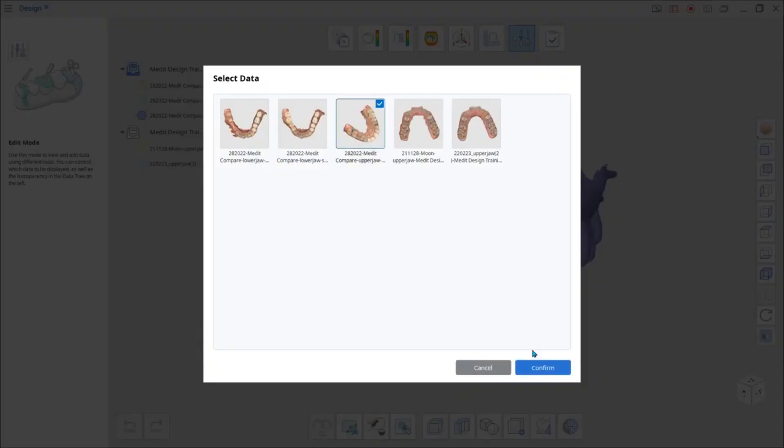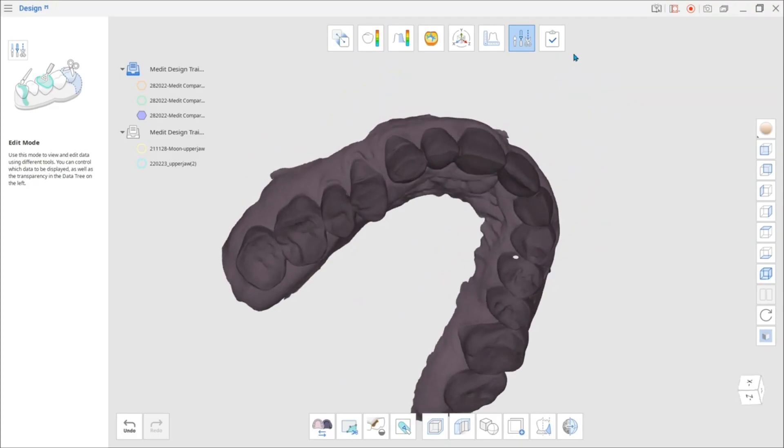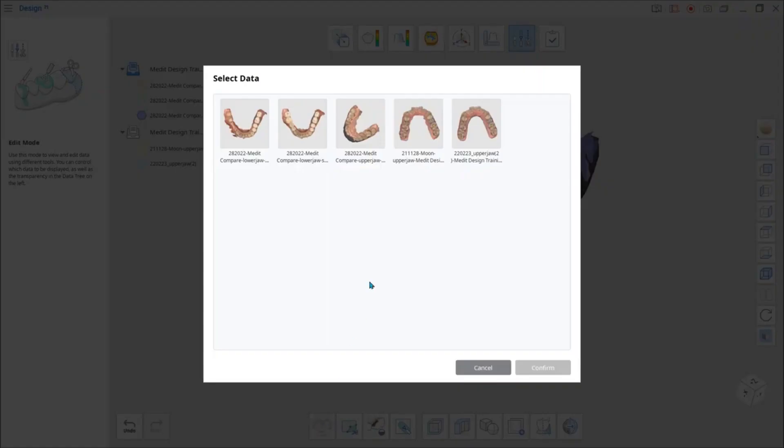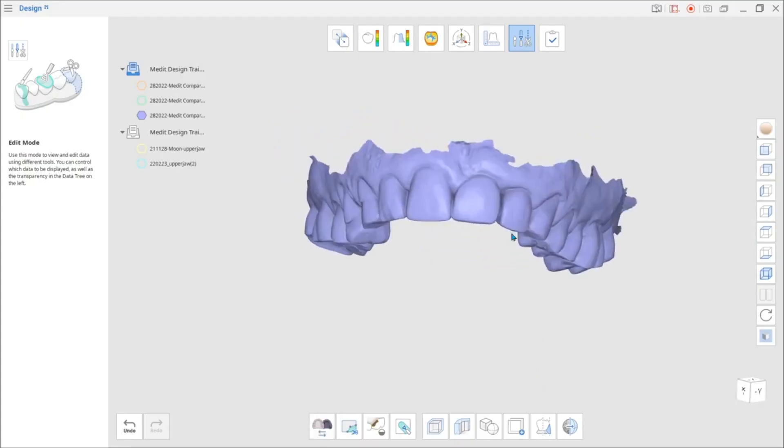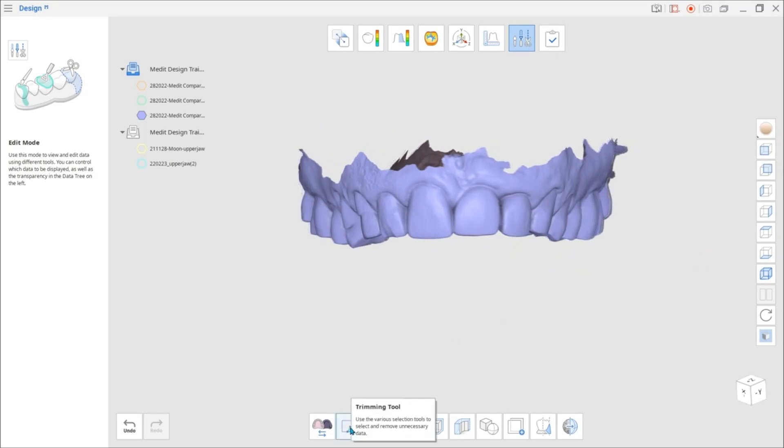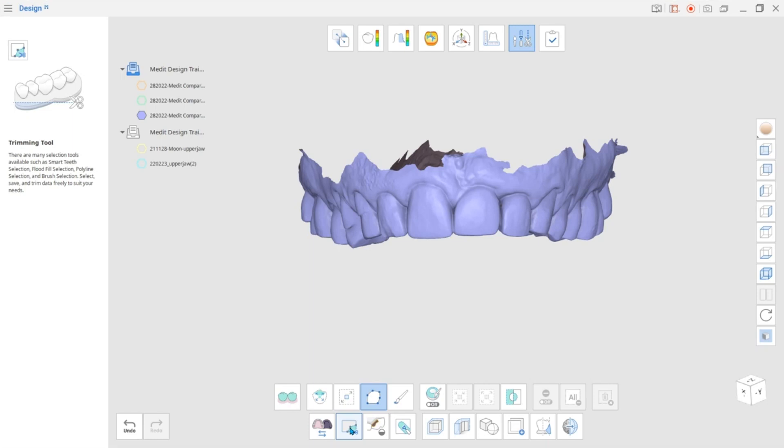Use the Reverse Data tool to turn the data surface inside out. If you need to remove certain parts of the data, use various selection options available under the Trimming tool.